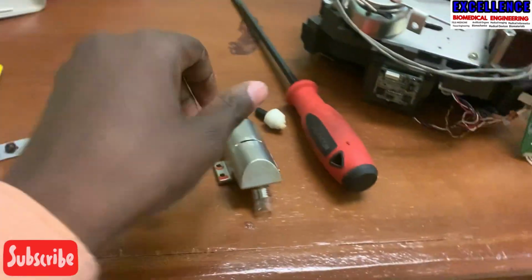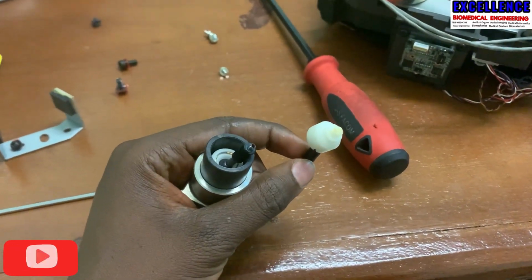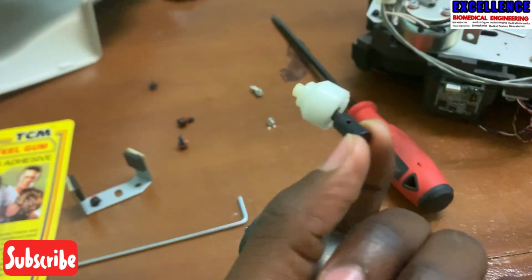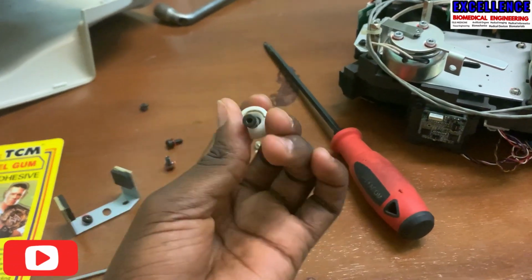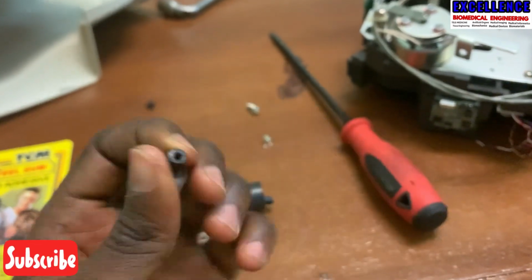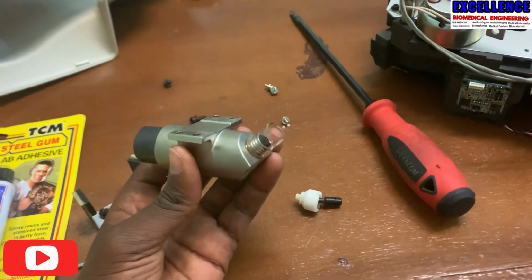In cases where you have this piston, it doesn't stay even if you fix it back, because the plastic over here has slacked so much. So the threading is gone bad. So what you do is, in most cases, talk to the original manufacturer.